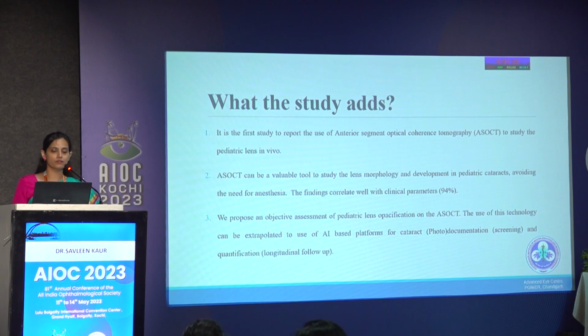It is a valuable tool to know the lens morphology and the capsule without the need for anesthesia, and the findings correlate well with the clinical parameters. We also propose an objective assessment of lens opacification. In a country like ours, where there is no concept of neonatal screening, maybe this quantitative analysis can help us in longitudinal follow-up of patients.